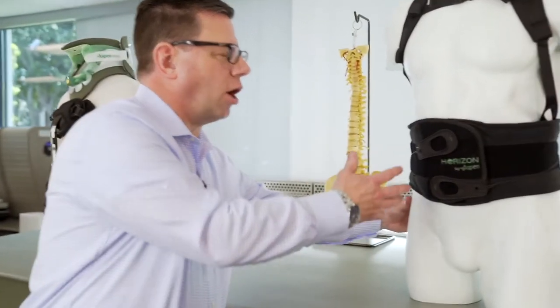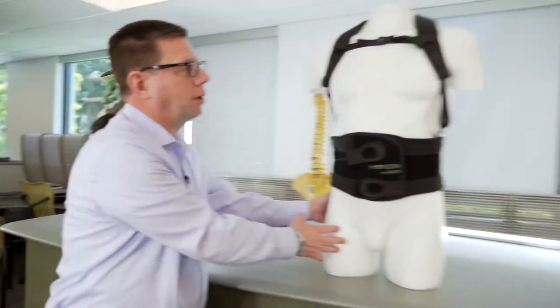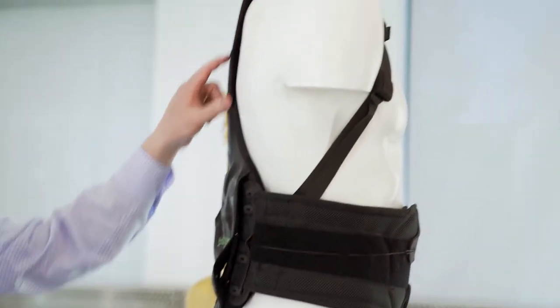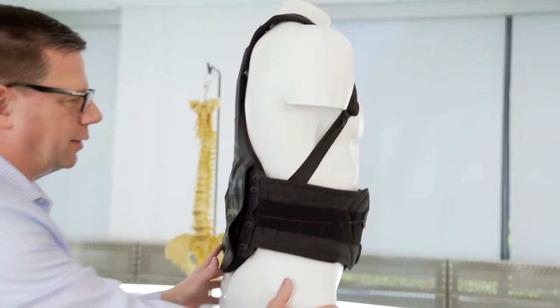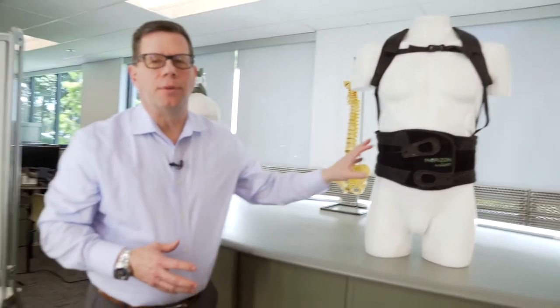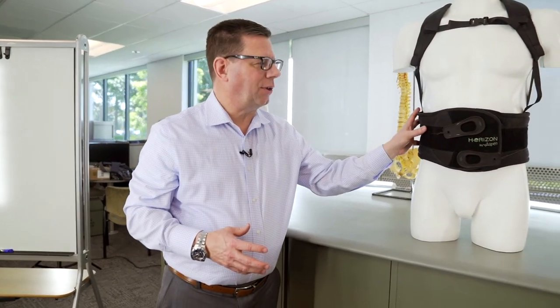The 456 is also a TLSO, or thoracolumbosacral orthosis, but it has backpack-style straps connected to the posterior panel. This is appropriate for compression fractures, but also when the patient can't handle or is not compliant with the larger, more rigid 464-style TLSO.